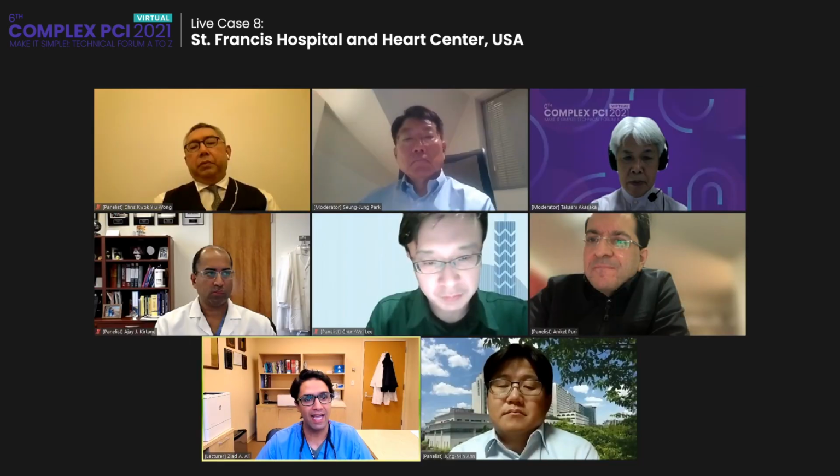Now, I know in India, you have the thinnest version. So this was an iteration. When it started, it was thick. To reduce the profile, we reduced as much as possible. Got it very, very thin. Then it started rupturing a lot. And so we actually went back to the middle, and now there's an intermediate thickness of the balloon which ruptures less. You just don't have that quite yet.